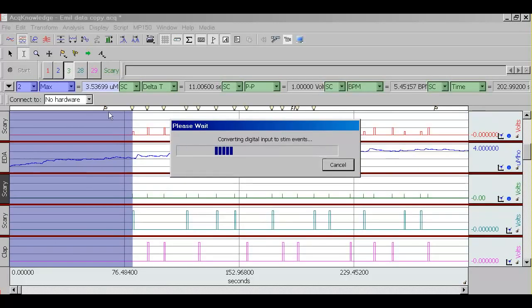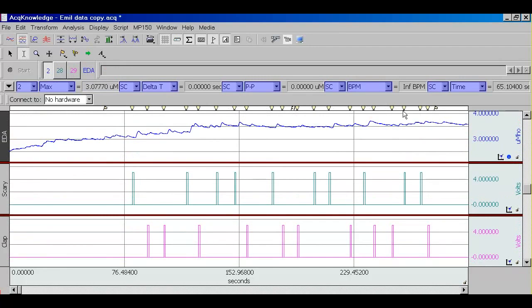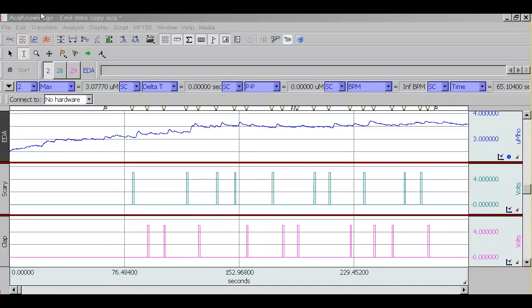And you will see now up here where global markers are placed, these light bulbs called stimulation event markers will appear. And each of them has a label. This one has a label 1 and this one has a label 2. And as you can see, they correspond to the first and the second channel of stimulation data respectively.